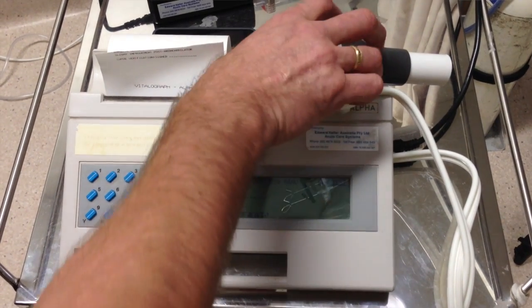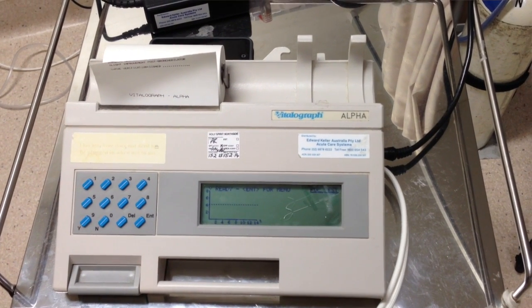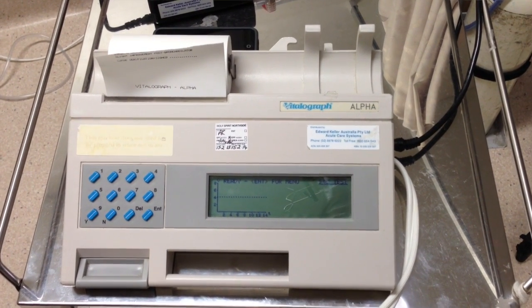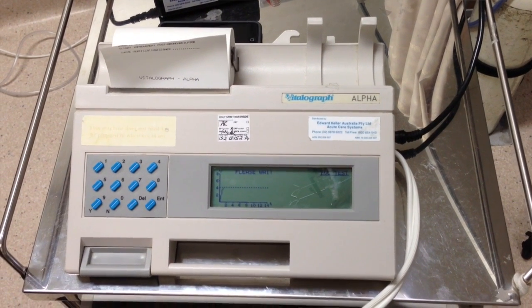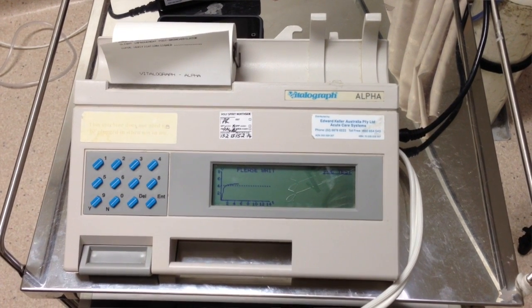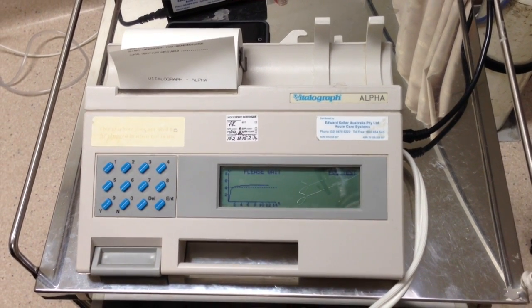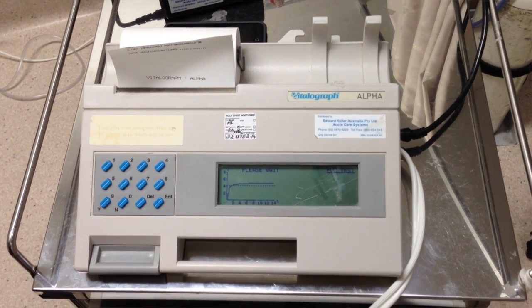So I'll explain to Derek: take a big breath in, put your lips around the outside, and blow out as hard and as fast as you can until I say stop. On your marks, get ready — big breath in and go. Blow, blow, blow — keep pushing, kick down, kick down. All right, that'll do. That was really good. The line keeps going because this test lasts 14 seconds, but it's very hard to get someone to breathe that fast for that long.